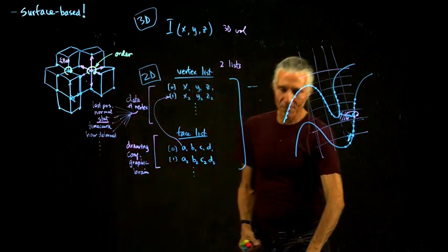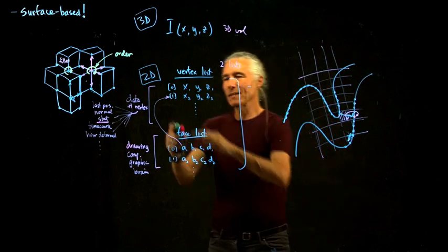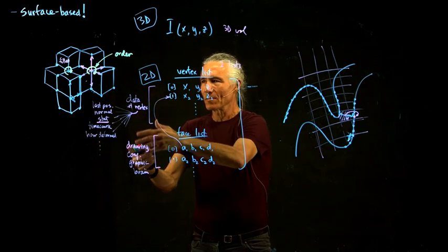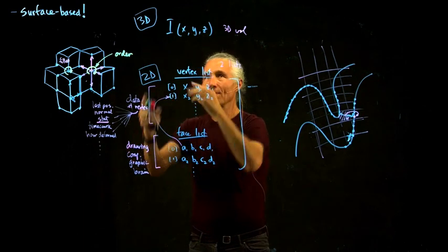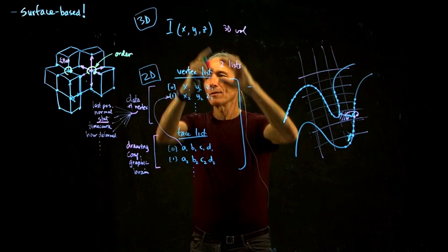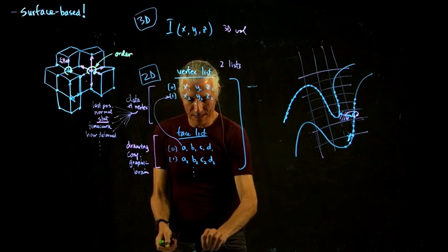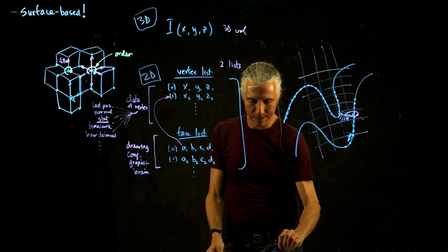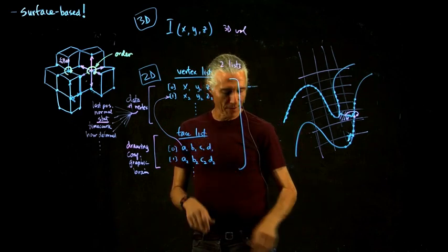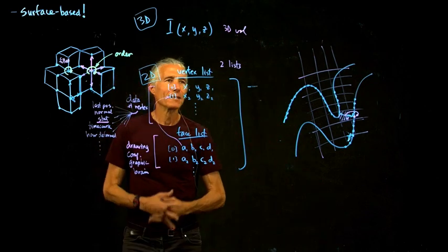And so you can see that this is a different way of dealing with the data. You've got these lists, basically a list of data at each vertex, and it's a different setup than a simple three-dimensional volume. It's a little more fiddly dealing with it, but there are a lot of advantages to doing this. You can unfold the surface, you can morph it into alignment with the other surfaces, which we'll talk about next time.